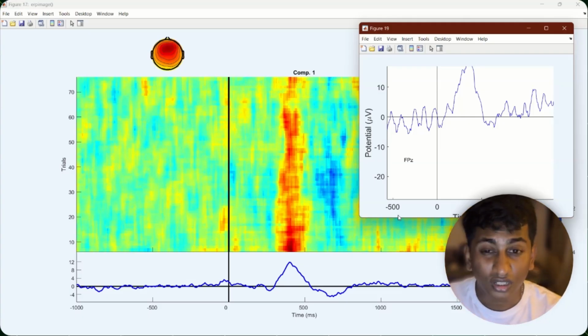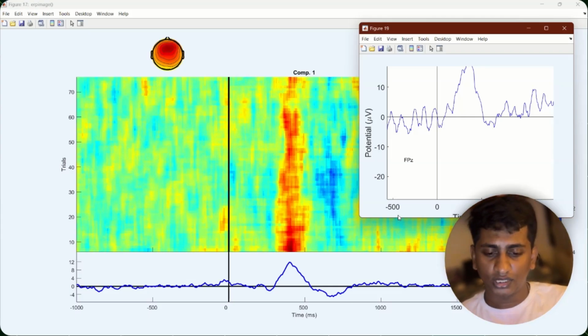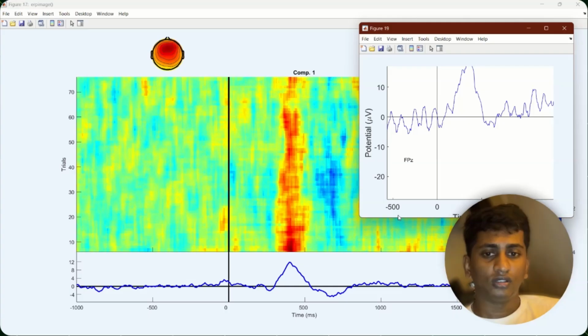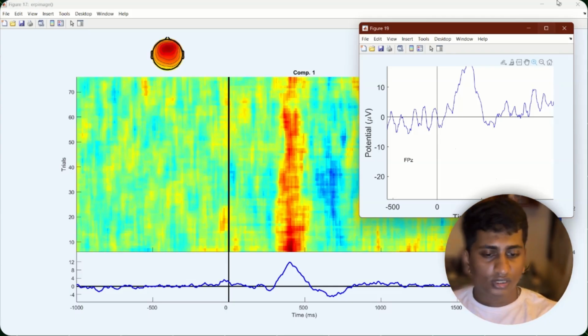I'll be uploading that. Apart from that, what is the tie-up for image processing? There is a spatial domain in this, you can see. The PSD plots and the per-channel PSD vectors can be arranged as PSD images, where rows equal channels and columns equal frequency bins. This 2D mapping is ideal for convolutional neural networks and 2D texture descriptors. So if you are going to use any machine learning model for artifact rejection or noise removal, like the gamma range, these kinds of things will be useful. Next, we'll be seeing time frequency.